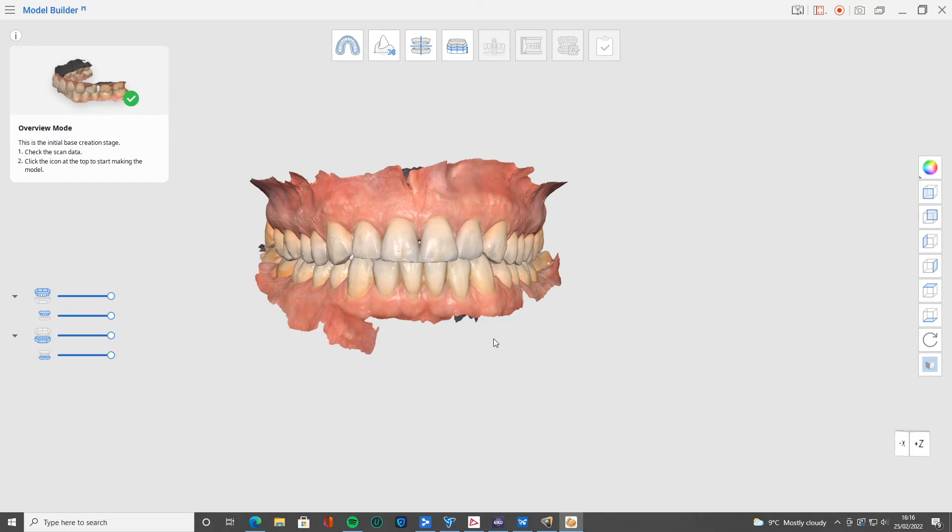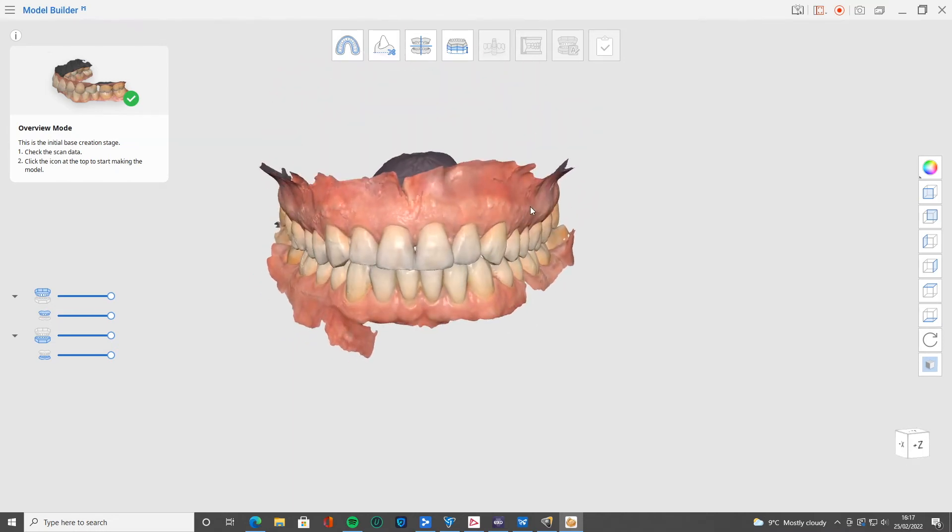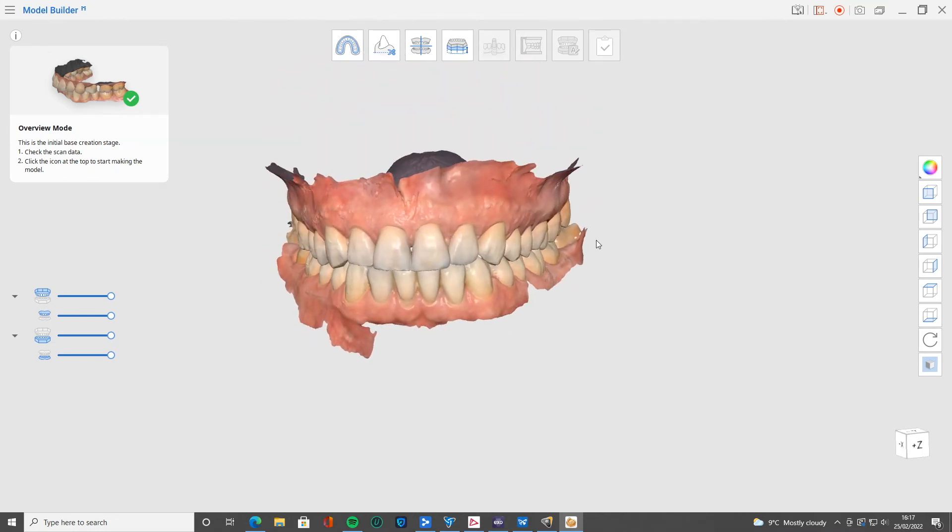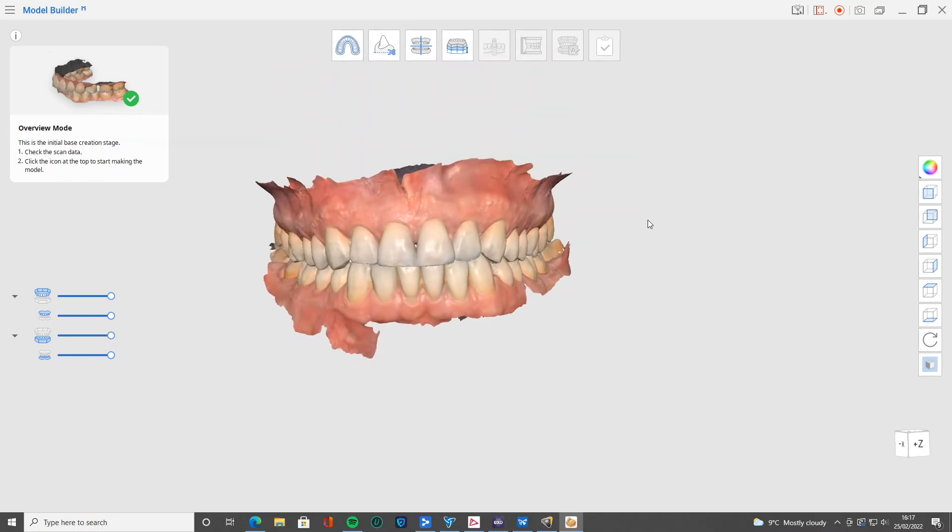But you've got to remember that this isn't a solid model. You will never be able to print this because it has no thickness. It is just a shell. You have to make the models watertight to be able to print them.